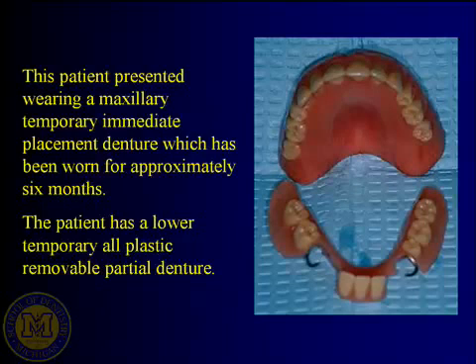So the remaining teeth on the lower arch, the teeth here and the teeth here, we presume at this time, if we're going to go forward with making a more definitive appliance, what are some of the things I want to have in my mind that I'm feeling comfortable about with these teeth? Any thoughts? Non-mobile. So one of the thoughts was you'd like to see, if you're anticipating using teeth as partial denture abutments, you'd like them to not be mobile or have good periodontal support.